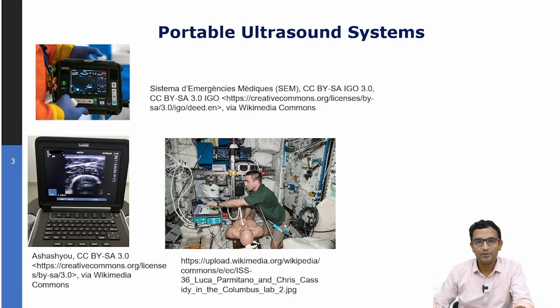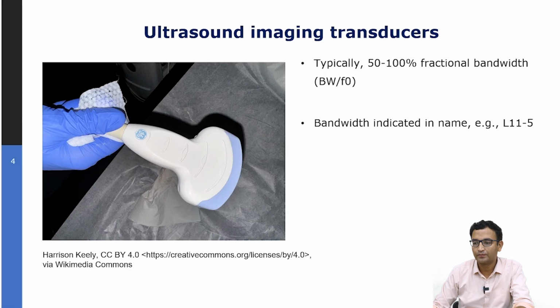The systems are getting miniaturized, and typically there is a relationship between the size of the system, the power of the system, and the image quality that you can produce with the system. However, as the electronics is getting miniaturized, the systems are getting more and more powerful.